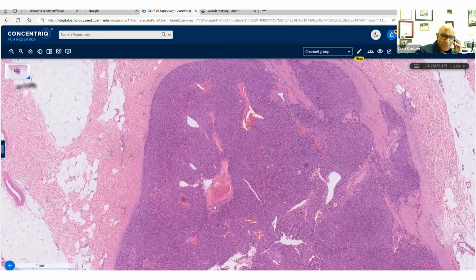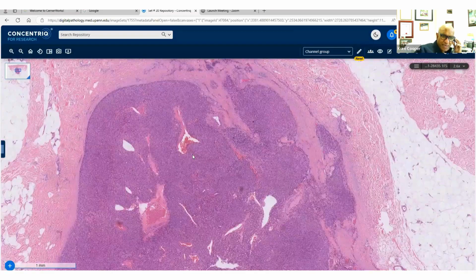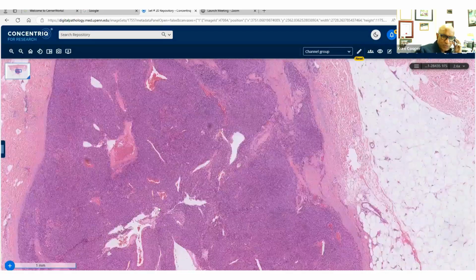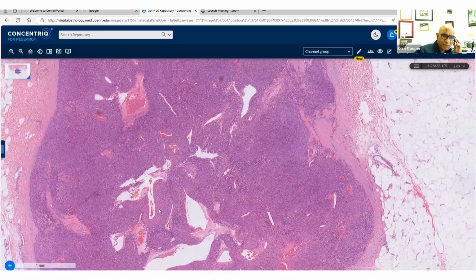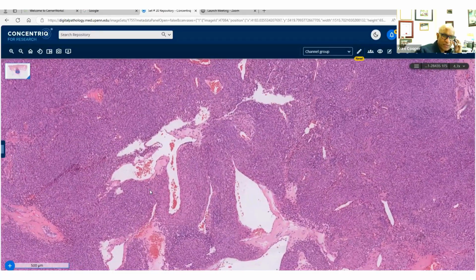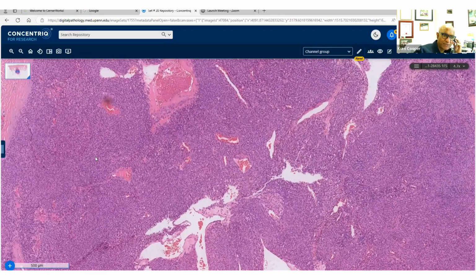You can see these vascular spaces here, okay? And some of you may like to call these staghorn vasculature, which is a useful feature that helps one determine that it's neoplastic, staghorn vasculature, or the old term being hemangiopericytomatous vessels.